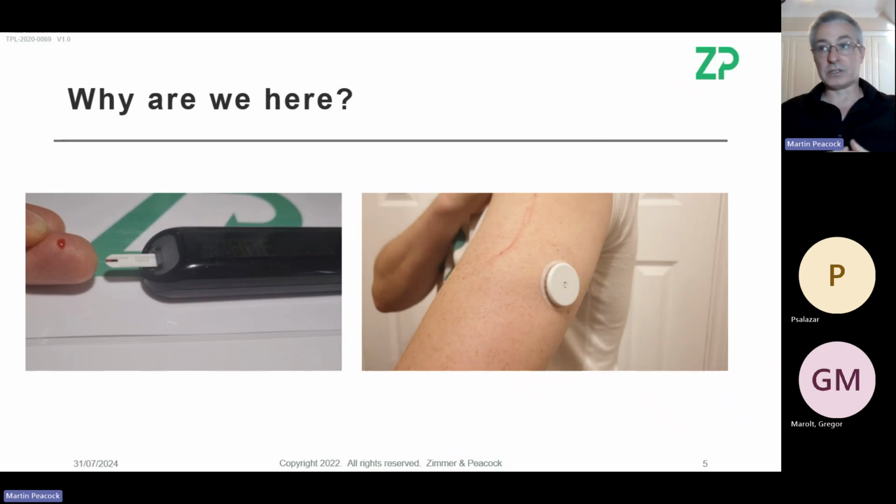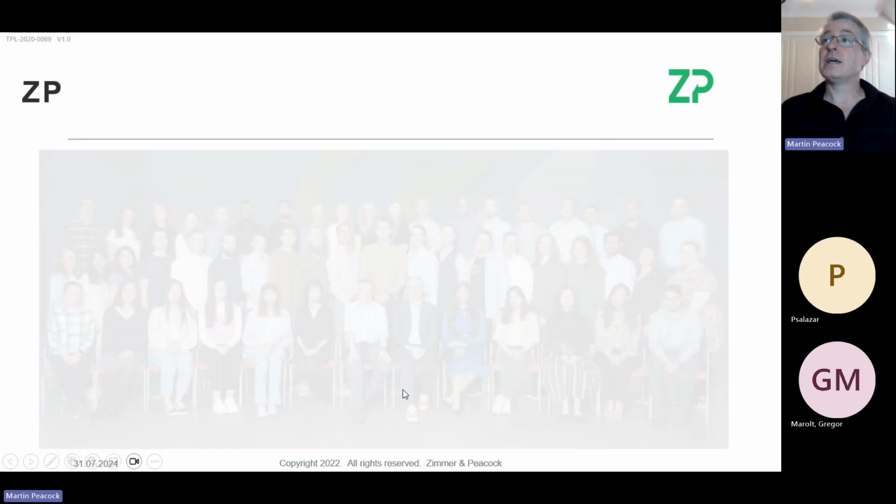The reason I bring that up now is because the fundamental science that TheraSense, and later Abbott, who bought the IP and the company, developed was then and is now used in Abbott's FreeStyle Libre 2. So if you ever want to understand the FreeStyle Libre 2, read the papers from Adam Heller on osmium complexes. To summarize, it's electrochemistry. Whether you're doing blood glucose monitoring or CGM, in the end it's electrochemistry, and there's not that much difference in the science. The story of Adam Heller and TheraSense is possibly an example of that.